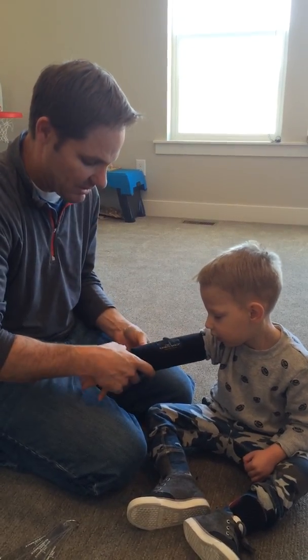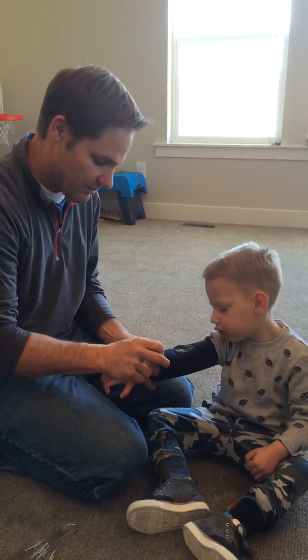And then kind of feel how it goes. I'm gonna take one tab off and tighten it up just a little bit more.